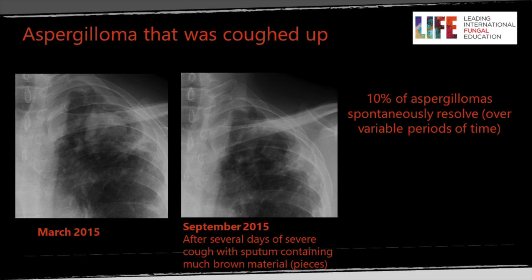Aspergillus can spontaneously improve. These chest X-rays from March to September 2015 show this happening: in March there's a classical crescent around a fungal ball, and then after a few days of heavy coughing with brown material, the cavity appears clear. However, this improvement doesn't mean the patient is cured — the cavity is still infected with aspergillus. Any neovascularisation will still be there and the patient should ideally have a CT scan and if necessary an angiogram to check further.